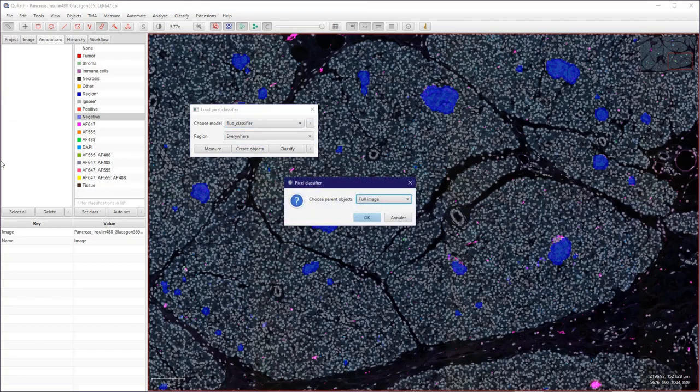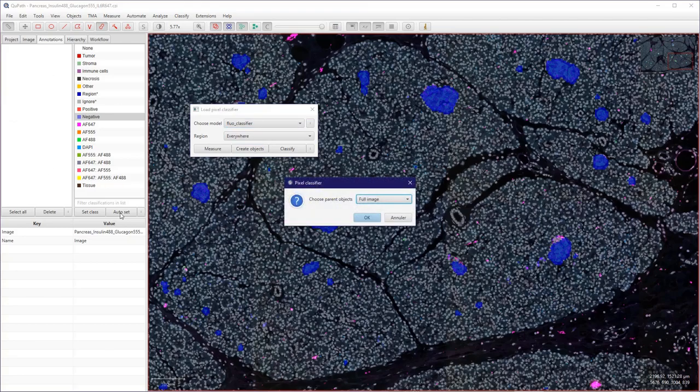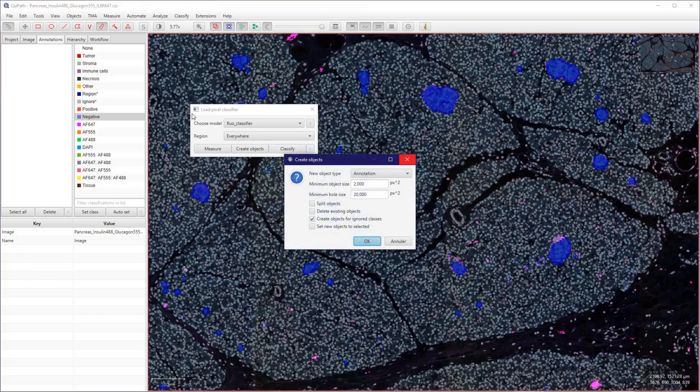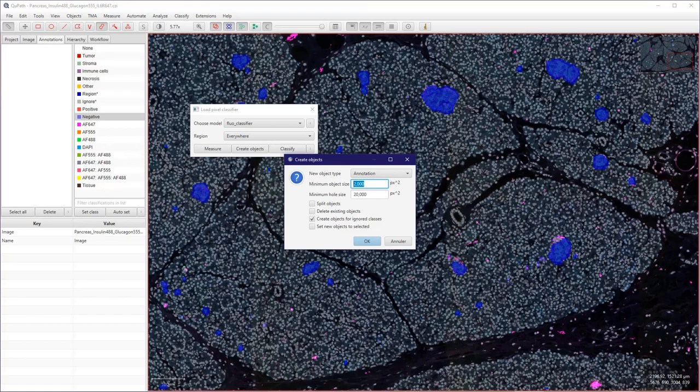Press OK and I used some presets here to fill the holes and to select only objects larger than a certain size. So I just want to keep the large objects here.